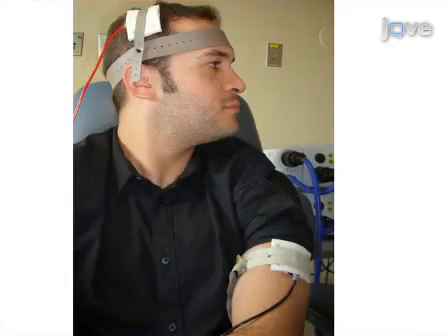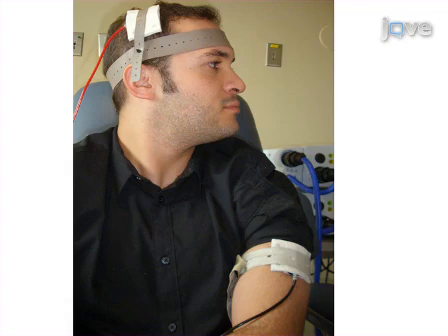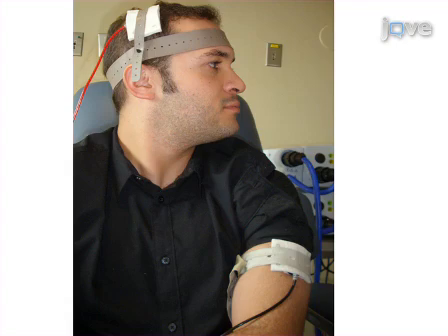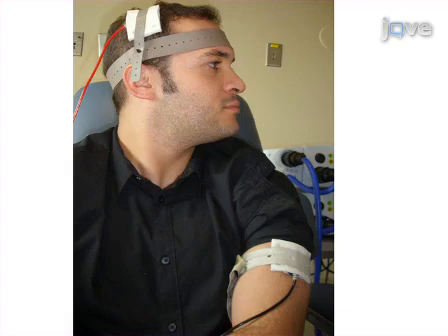One important point is the location of the reference electrode. If an extracephalic position is chosen, the investigator should be aware of current distribution, as the reference electrode might displace the peak of induced current and modify the effects of TDCS.